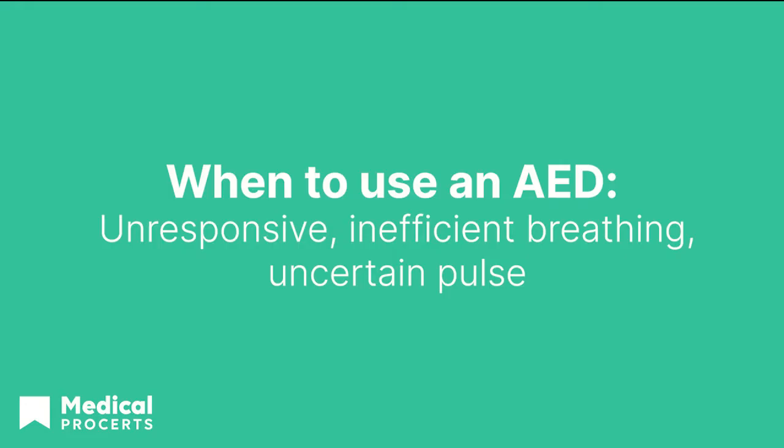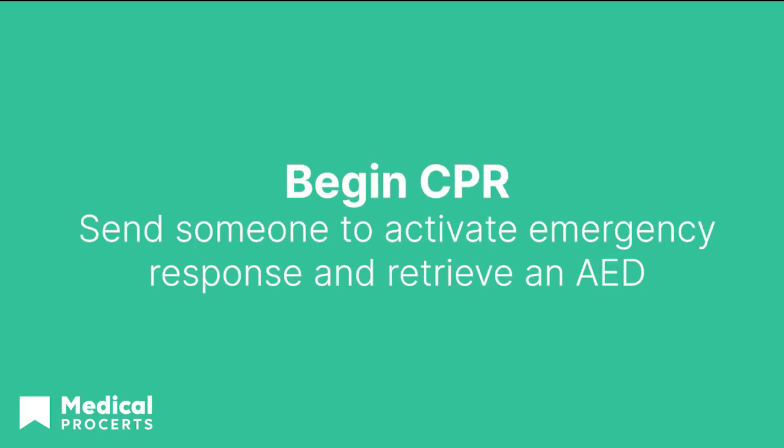A provider should only apply an AED to a person if they are unresponsive, not breathing or breathing ineffectively, do not have a carotid pulse, or the provider is unsure of a pulse. Remember to clear the scene for safety before approaching the person.